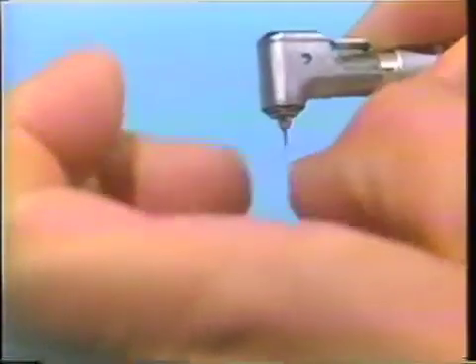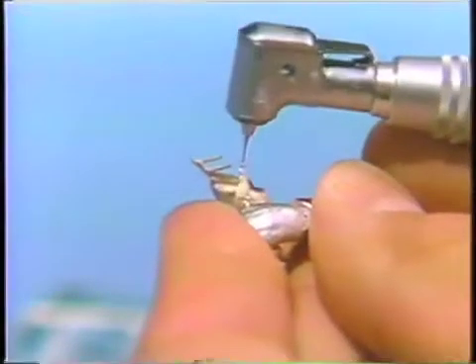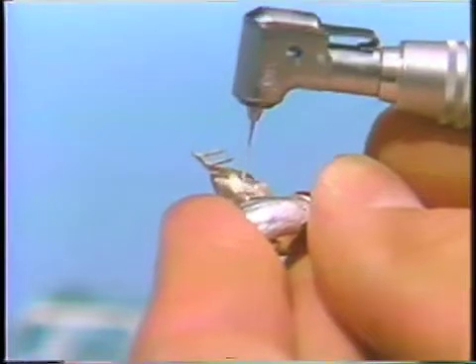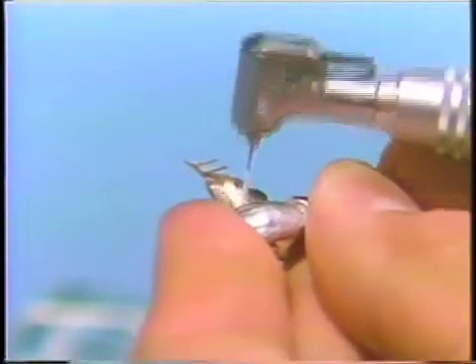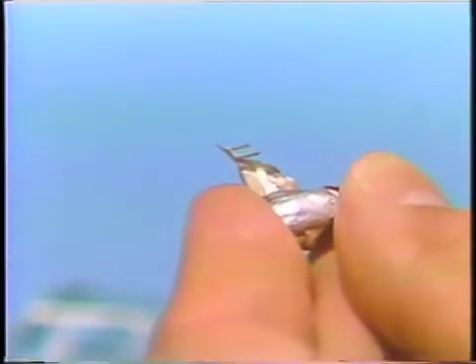The direction of the spin is checked with your fingernail. Zinc phosphate cement is then spun down the pinholes, making sure that the cement flows all the way through the pinhole onto the lingual surface. If the spin of the spiral is in the wrong direction, the cement will be pulled towards you and not into the hole.